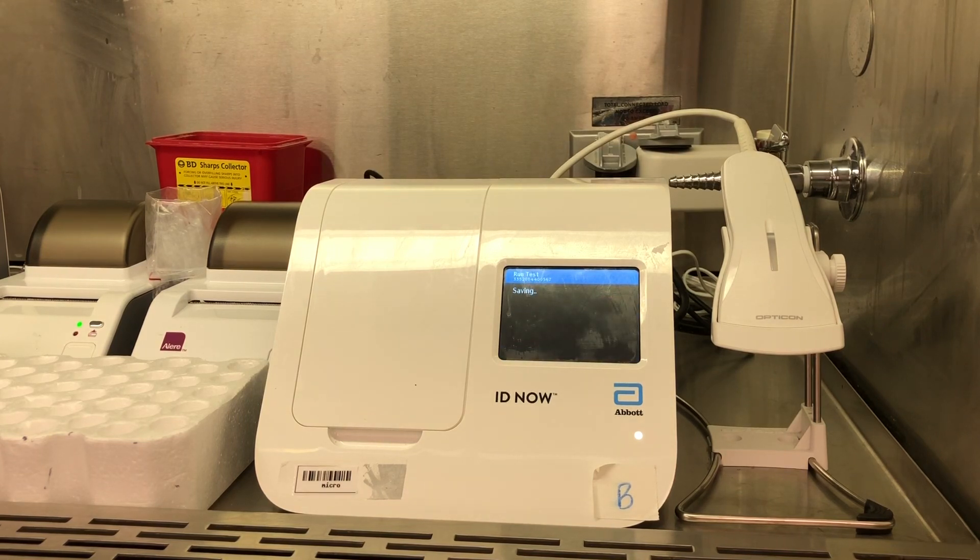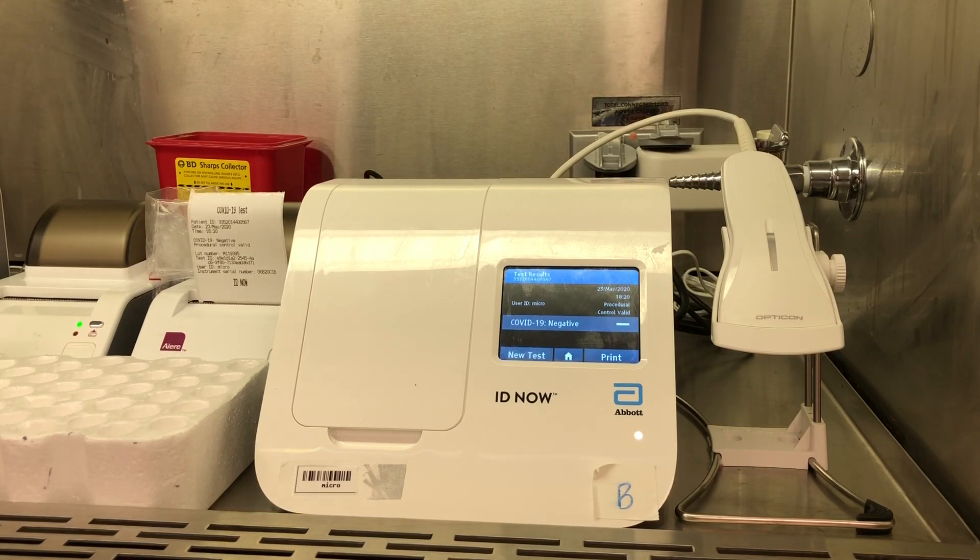After it has completed the test, it'll save to its internal storage — you can see there it says saving. This takes a few seconds to complete. Once the saving process is done, it'll display the results of your test, and it'll also print a sticker from the little printer to the left of the ID Now. This patient was negative.